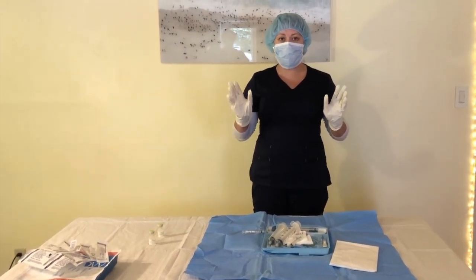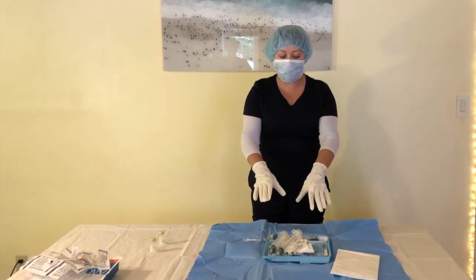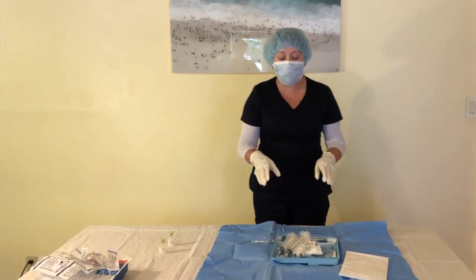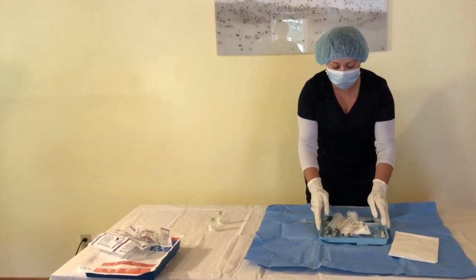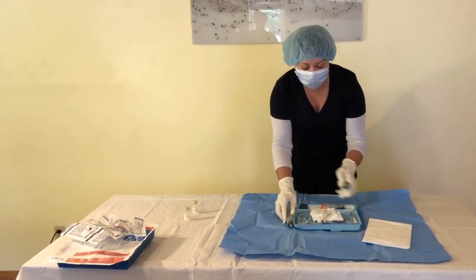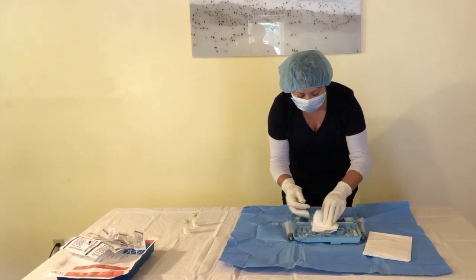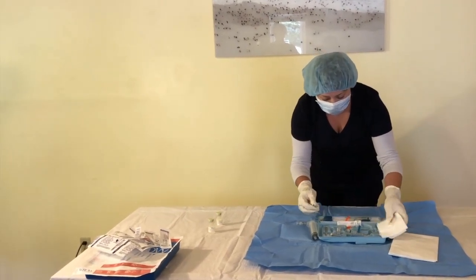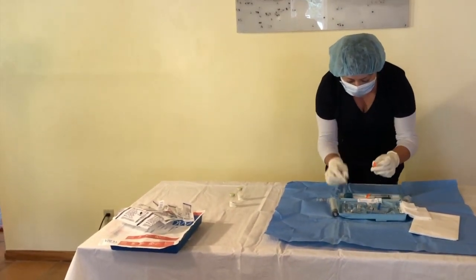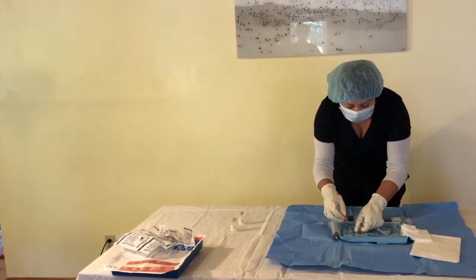Now that we have everything on the prep tray, everything on it is going to be sterile. So I need to make sure I don't cross-contaminate. I'm going to organize everything so that the doctor is able to grab everything and see what he needs at that moment. So we have the large syringe. Right now I'm going to put that to the side and I'm going to get all the needles together. So here's one sharp, here's another. I will place these together so that they can find it.